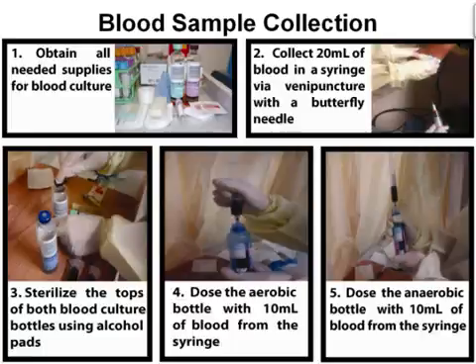Please note that while the collection protocol calls for performing venipuncture whenever possible, depending on the patient, it may not always be the best method. For example, in severely burned patients, venipuncture is not recommended due to the lack of innate barrier to infection and possible contamination. In this case, blood is drawn from a line, frequently an arterial line. The issue here is contamination.